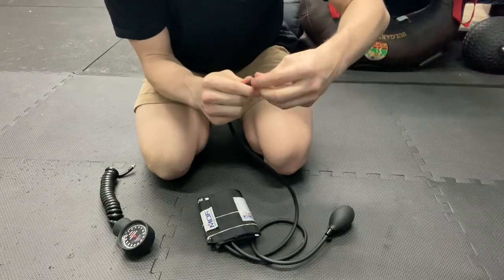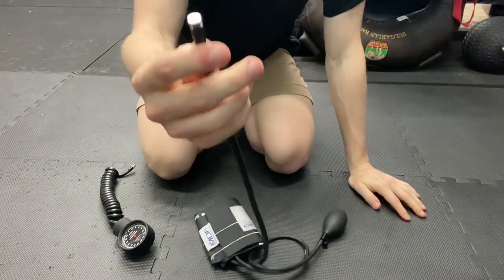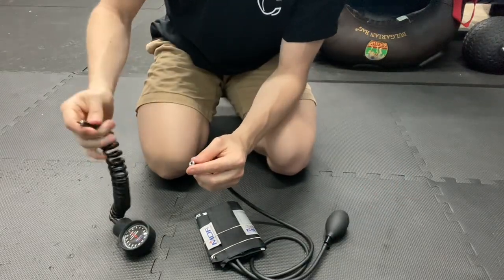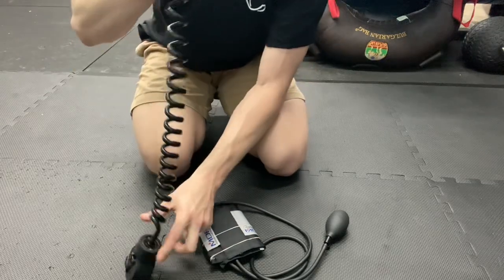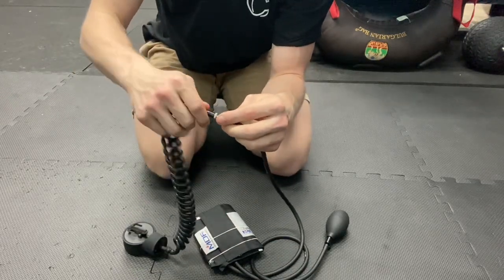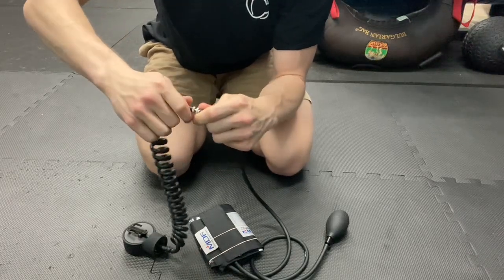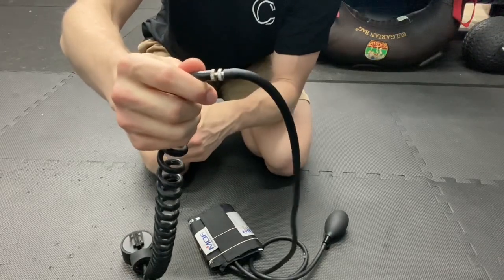There we go. You could probably get it a little bit further than that, but it's in there pretty solid. Then we're going to take our male connector, so the opposite end of our gauge now, and simply put the male connector in the female connector. You may hear a slight click, but these two do not go all the way together in my experience.